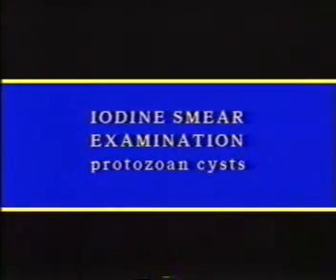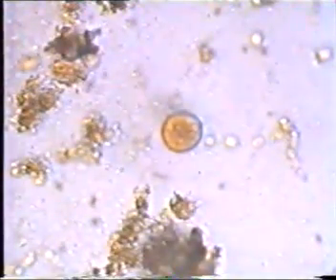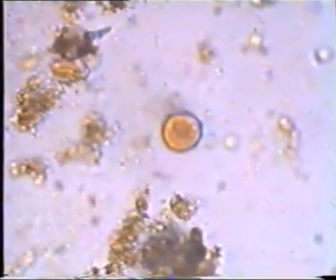Examination of the iodine smear should also be done in the same systematic manner, locating the cysts under low power and then identifying them under high power. In identification of cysts, these characteristics are of importance. When counting nuclei, focusing with the fine adjustment is necessary since nuclei in the cysts are in different planes. Here you see an Entamoeba coli cyst with nuclei in different planes.